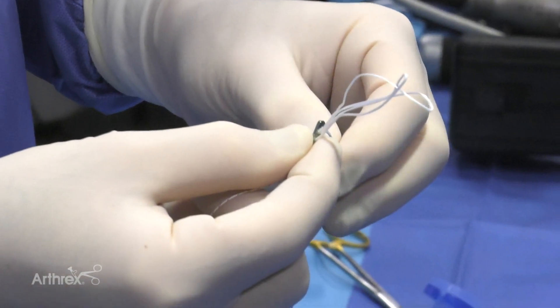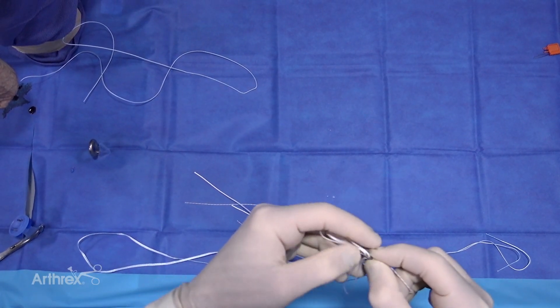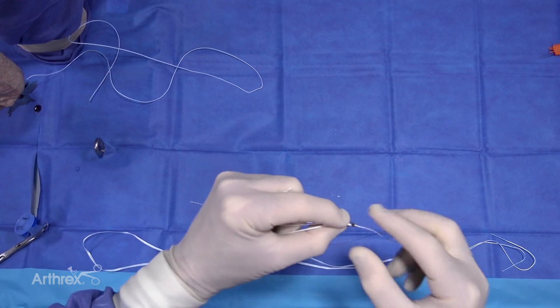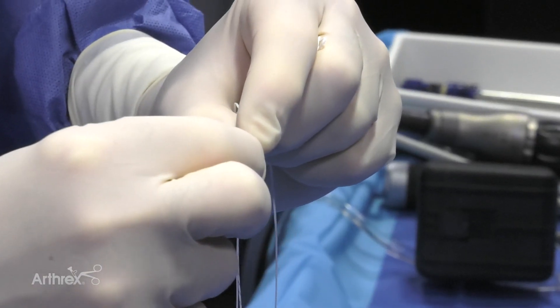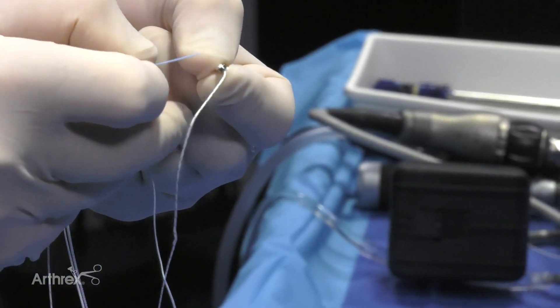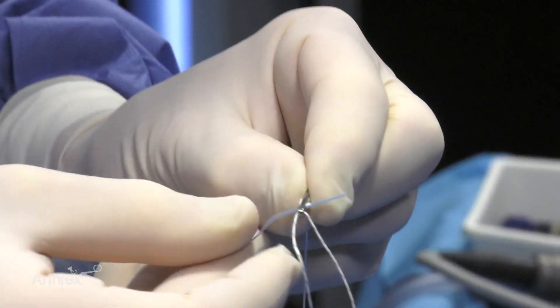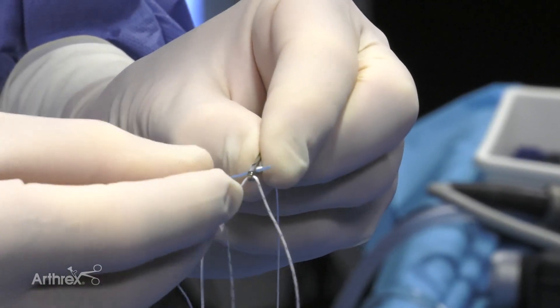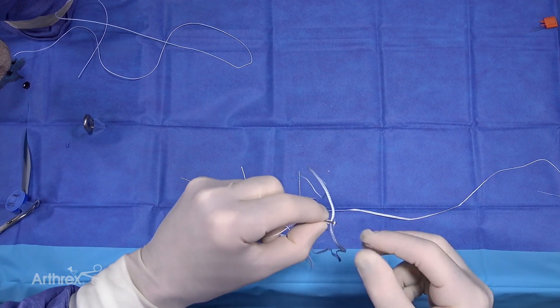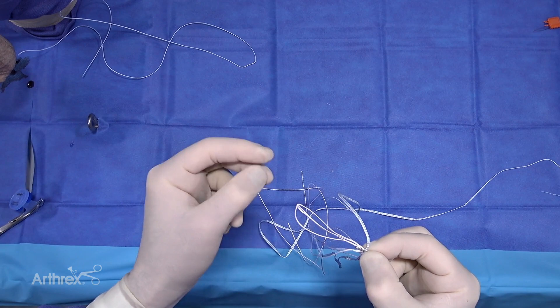To pass the fiber tape, we're first going to remove the number five suture. We're going to pass the stiff end of the fiber tape through this hole alongside our mechanism. The fiber tape has a stiff waxed end, so we can pass it through alongside as seen here. We want to make sure that there are two passes through the button with the fiber tape, oriented so that the two free ends of the tape are going to be on the tibial side.